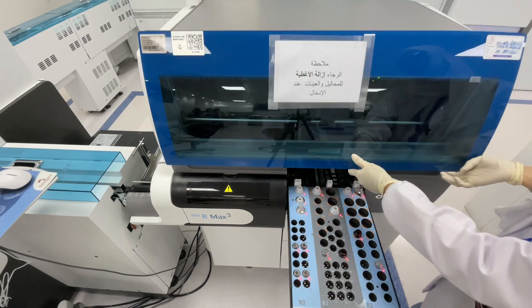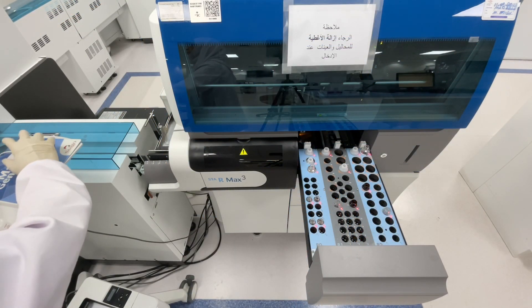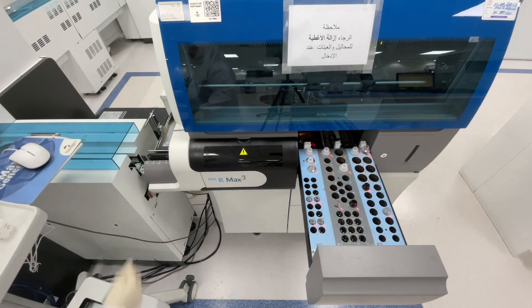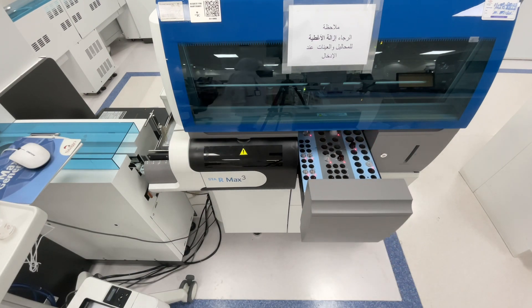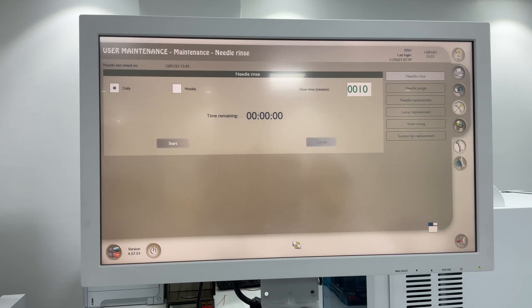Close the hood. We will continue and the drawer closes. Then for Needle Purge, you can click here below.